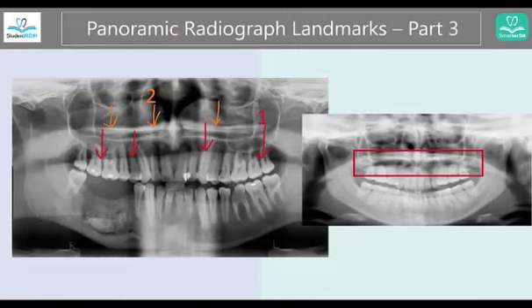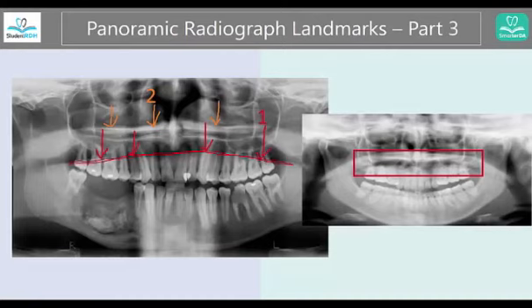Number one is indicating this line here. What would that be? This is going to be the tongue. If you don't put the tongue on the roof of the mouth in an L shape towards the tip of the palate, you will have this radiolucency — the dark area — because this is actually the airspace. That's why we ask our patient to swallow first and then put the tip of the tongue to the palate and stay there until the panoramic radiograph is done. This is actually just the border of the tongue.